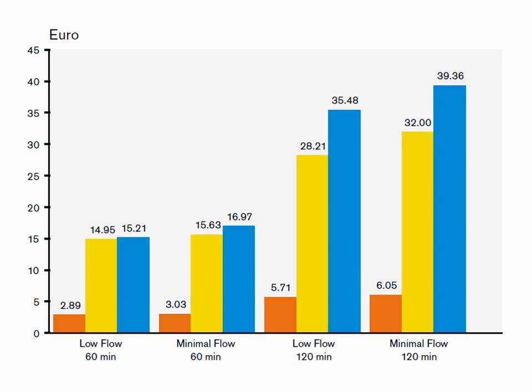I could only find figures in euros, but as you can imagine, this is what you would save if you compared it to high flow rates. In the source that I used, high flow rates were defined as around 4 to 4.5 litres per minute. I'm sure no one uses such high flow rates during the case as maintenance anyway, but you can get an idea of how much you can save.